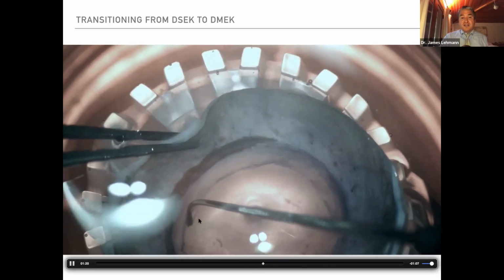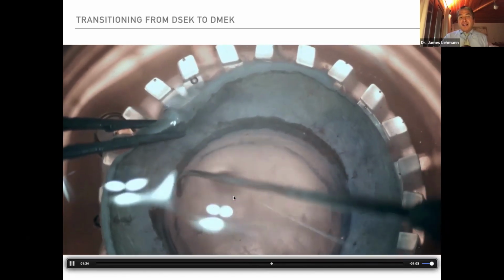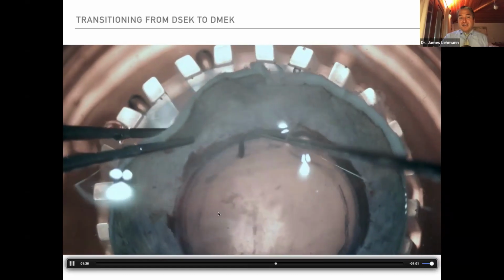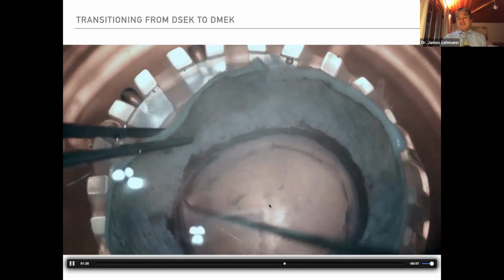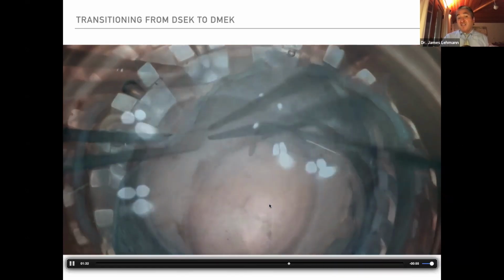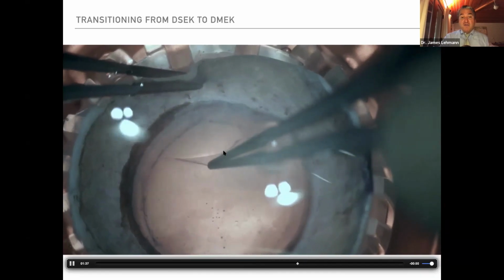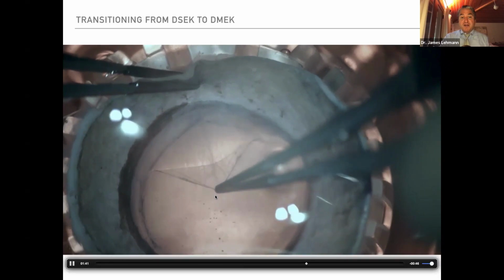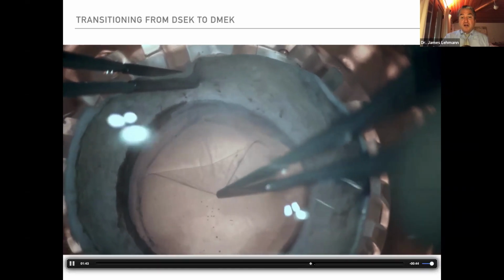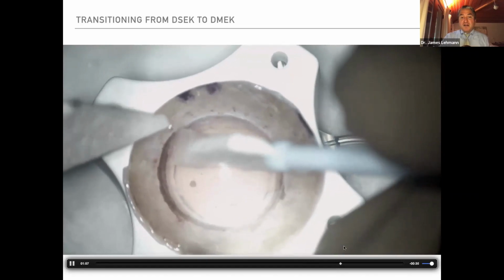So I'm going to let you see this a little bit. And then now when eye banks put S stamps on it, they put a hinge in the temporal or the lateral aspect of the graft. But what I'm demonstrating here, since I learned before we used to have S stamps, is we peel until the central 3 millimeters. So now that edge is 360 free, and then we're pulling it to the middle. And you want to pull it to the middle in all 4 directions. Here you can see. So it's been pulled to the middle in all 4 directions.